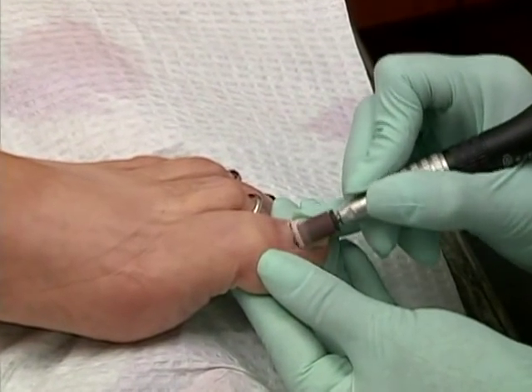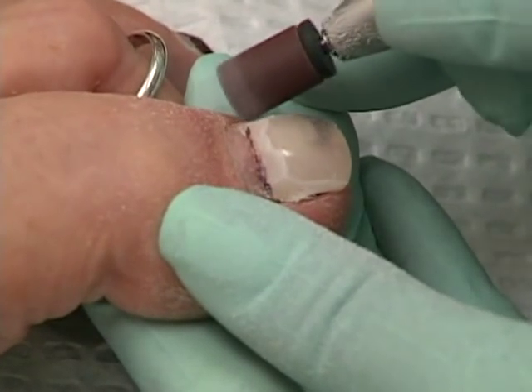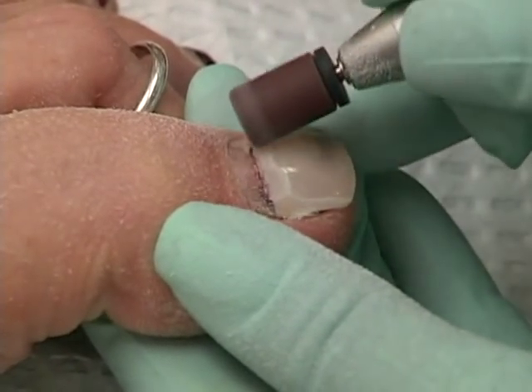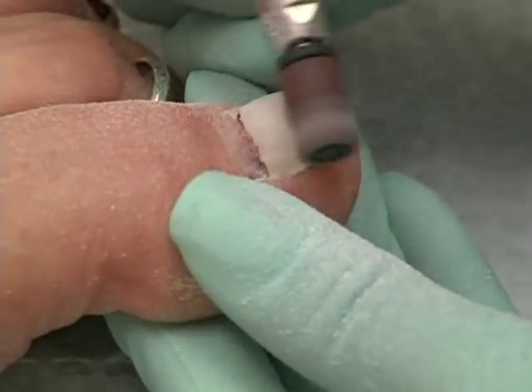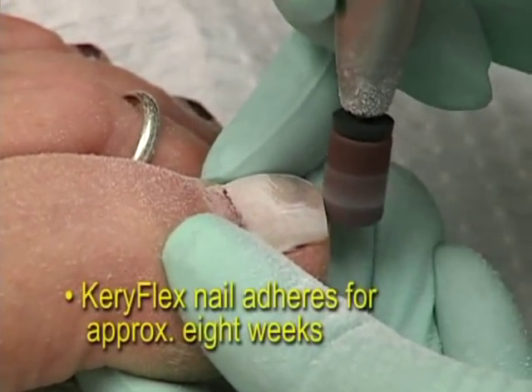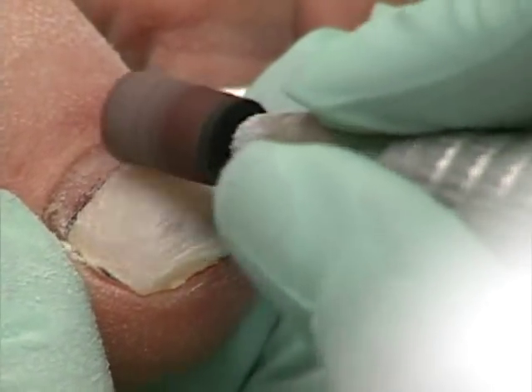As the natural nail begins to grow, the Keriflex nail will also grow with it. As the edge of the Keriflex nail extends beyond the edge of the fleshy part of the toe, the patient should consult you for a filing back of the nail. If the nail extends too far beyond this edge, there is a higher risk of the nail popping off from the natural nail. Under normal conditions, the Keriflex nail adheres to the natural nail for about eight weeks, at which point it may be time to examine the nail and repeat the procedure.